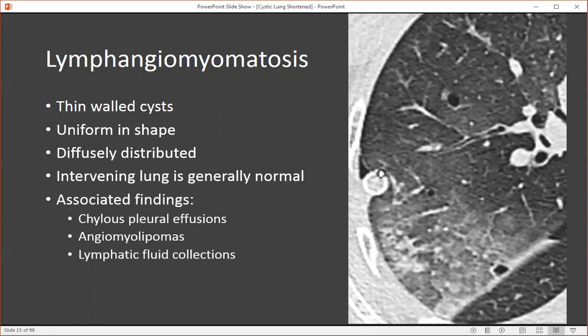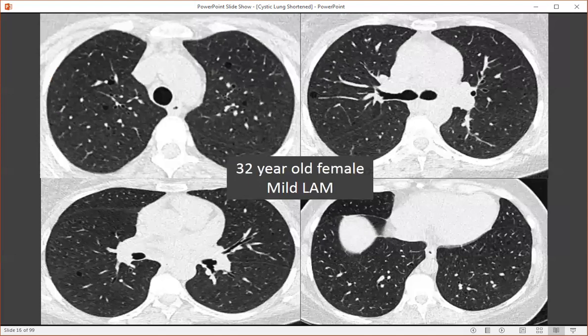Associated findings of LAM include chylous pleural effusions, angiomyolipomas that can occur in the liver, kidneys, retroperitoneum, or even the posterior mediastinum, and abnormal lymphatic fluid collections that can also occur in the retroperitoneum and posterior mediastinum.